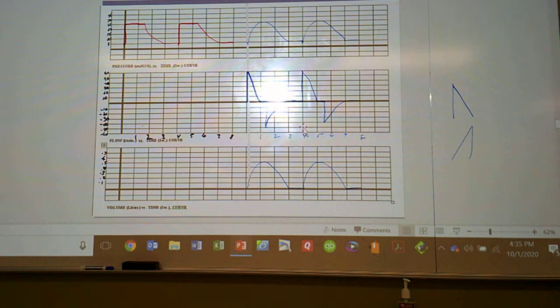But I just have to know that there's a 1 second pause. It's not the hold, no. The way I'm drawing it is so that patients don't have a situation where when they're exhaling, they immediately start the next breath. There's generally some time between breaths. From the time I stop exhaling and the time I start the next breath, there's usually a little bit of a gap in there.